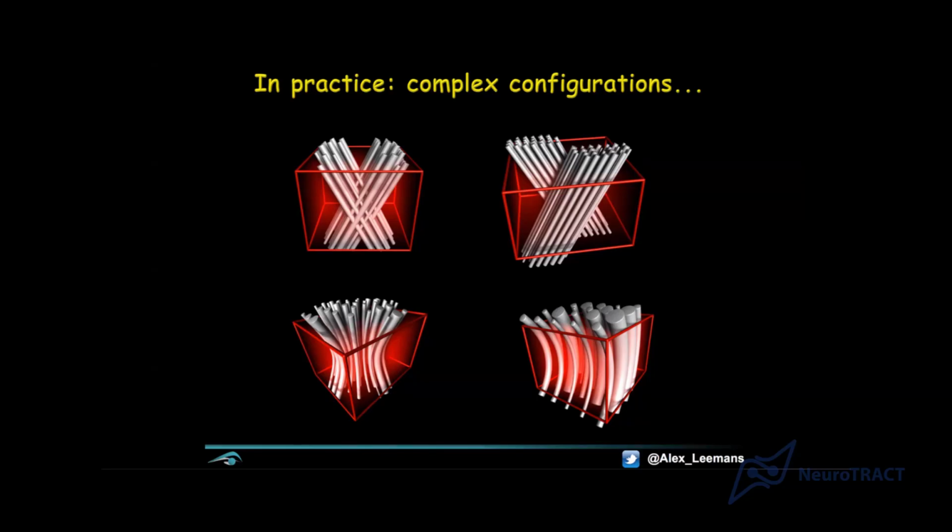One comment that we often received, or that was debated, was related to resolution. Because if you look at the right top example, you could say I see two crossing fibers. But if my voxels had a higher resolution, I might have been able to disambiguate both populations, like a little voxel in one population and the other voxel in the other population.